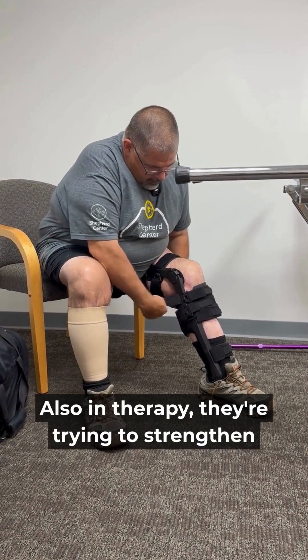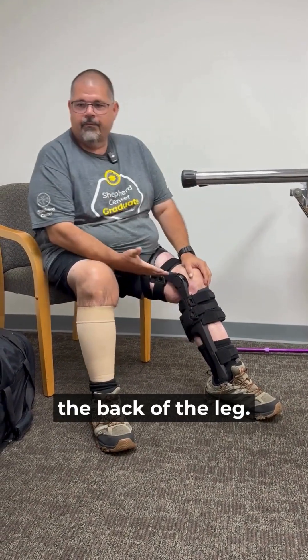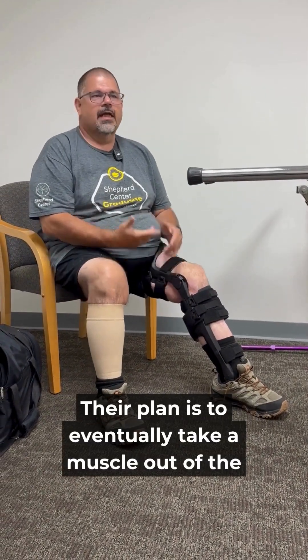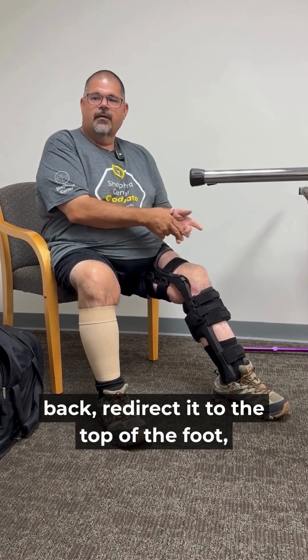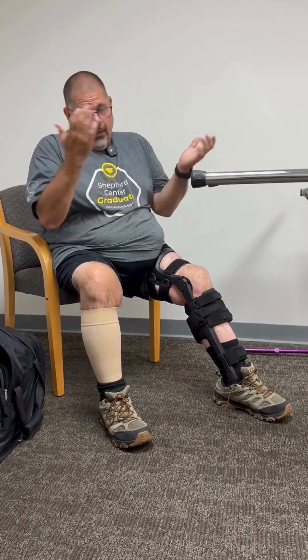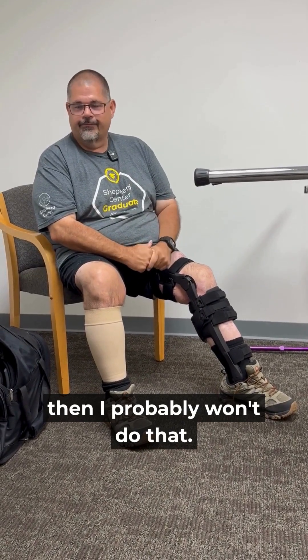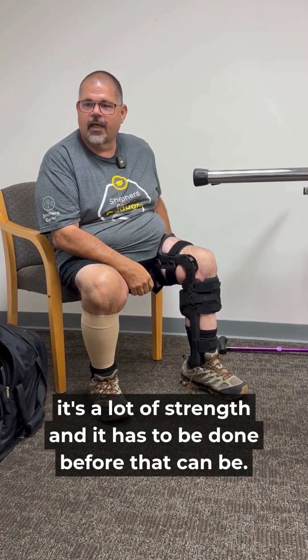In therapy they're trying to strengthen the back of the leg. Their plan is to eventually take a muscle out of the back, redirect it to the top of the foot, and retrain your brain to use that muscle to pick the foot up. But if the brace is successful and I'm happy with it, I probably won't do that — that's an option later.